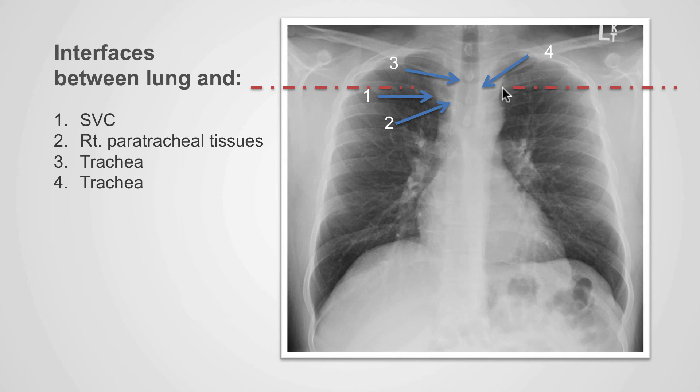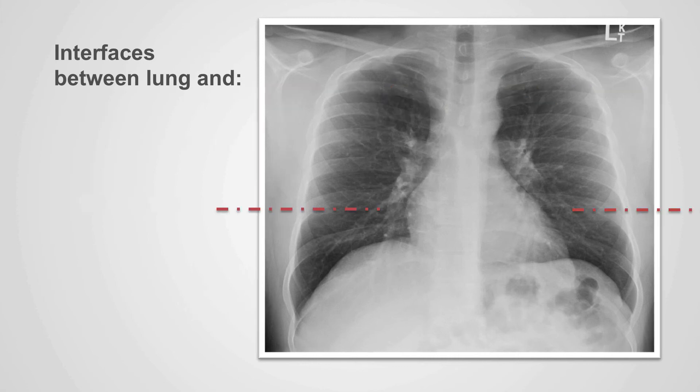On this side, we can identify a clear border. And do you know what that is caused by? That is the interface between the lung and the subclavian artery. Now if we moved our line more inferiorly, we can also identify various interfaces.